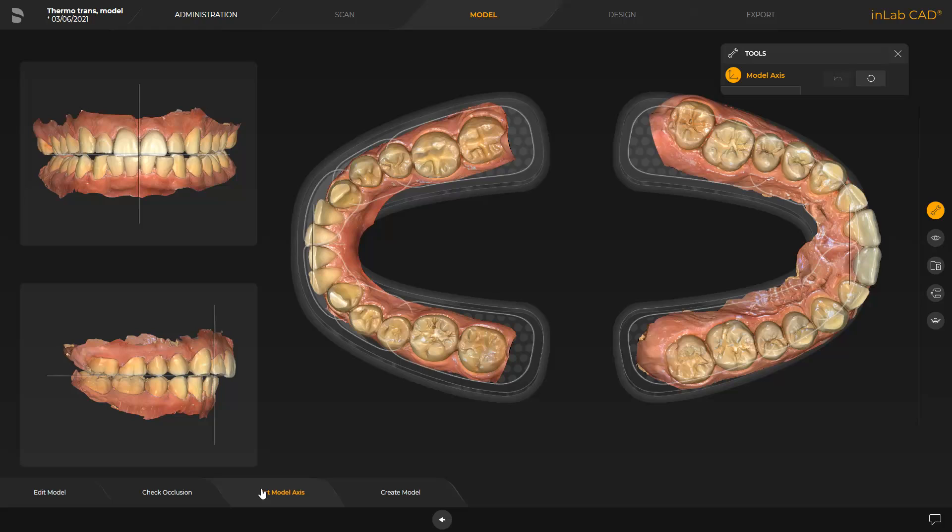The model axis is automatically suggested by the software. If necessary, modifications can be performed in three views. In our case, we proceed without any modifications and continue with the last step, Create model.